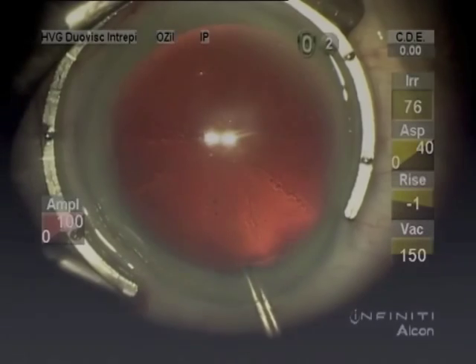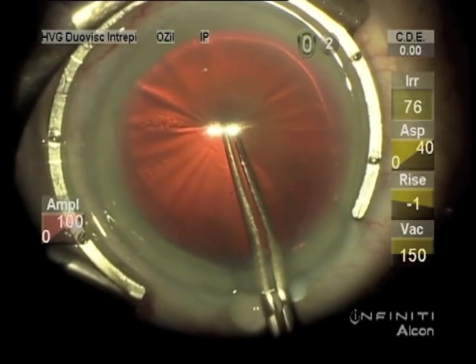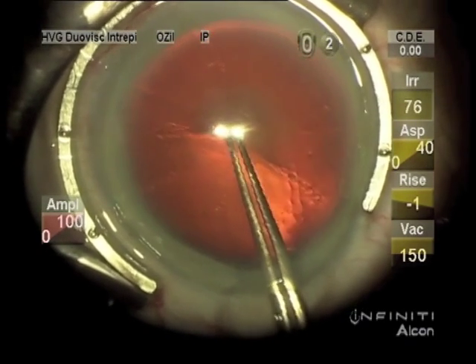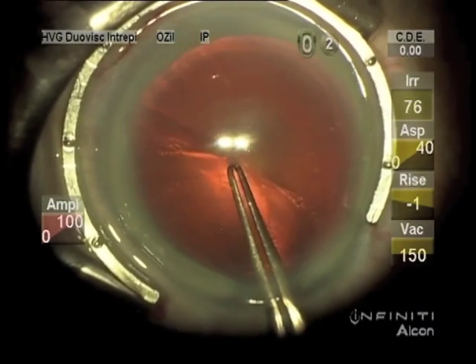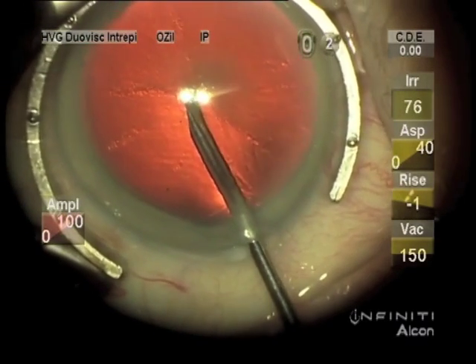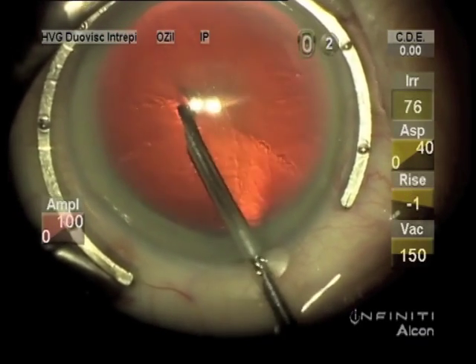Here's a case where this rather dull capsule forceps doesn't puncture the capsule. A sharper forceps would have, but if the zonules are weak or it's a young eye, then I will start with a sharp instrument — and this can be your disposable cystotome.